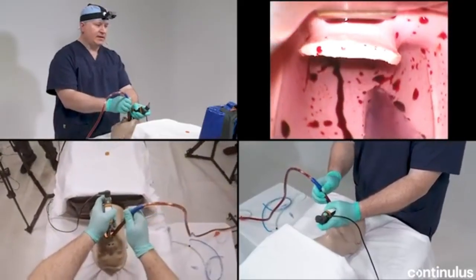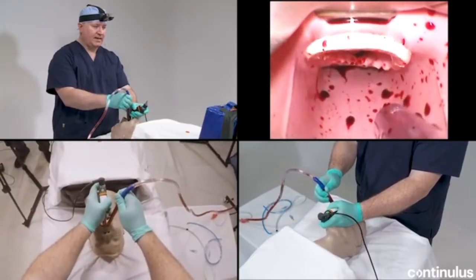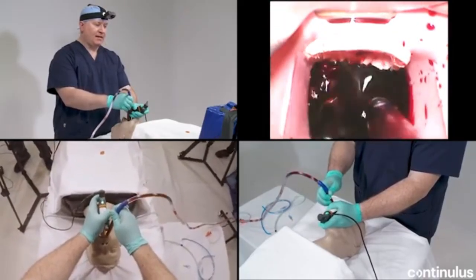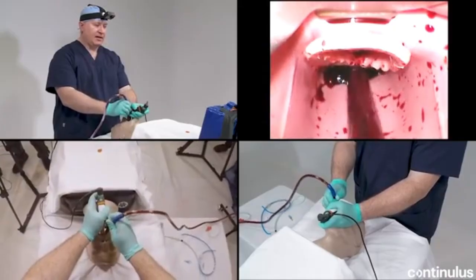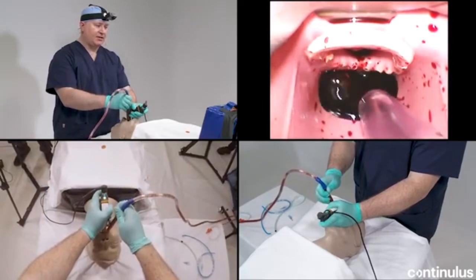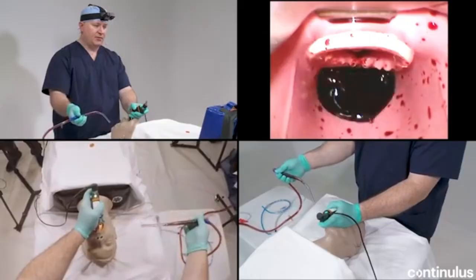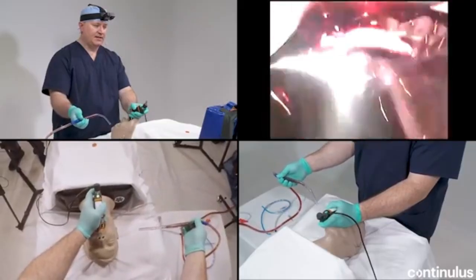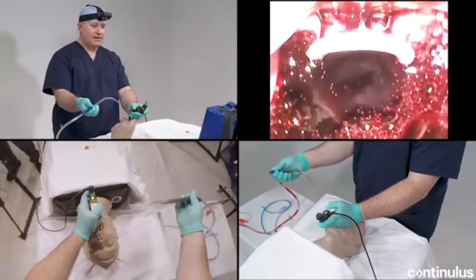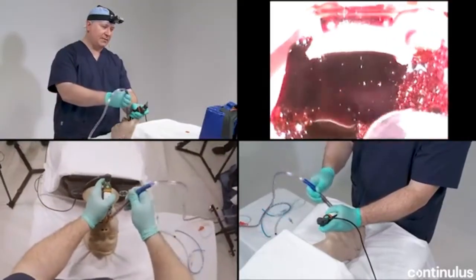What I'm going to do is several very simple and easy to understand techniques in order to understand how to maintain airway decontamination. James, give me 3 pumps on the handle here. The reason I would want to leave the suction in during the intubation attempt is in the case of continuing airway contamination. If I'm not careful and I take the suction out, give me 3 pumps, 4 pumps, that's it. I'll have a completely soiled airway, and now as you can see on the video monitor, I can't see the larynx at all. This would be a completely blind intubation.